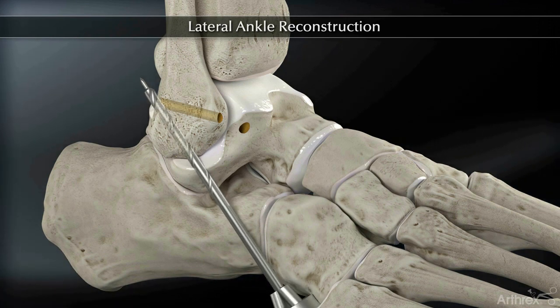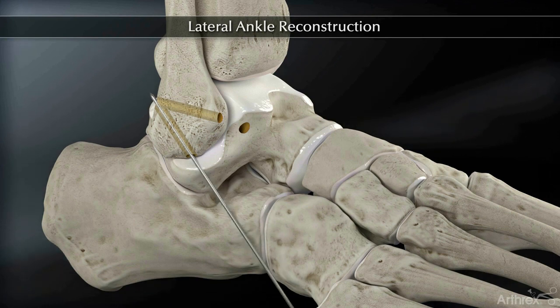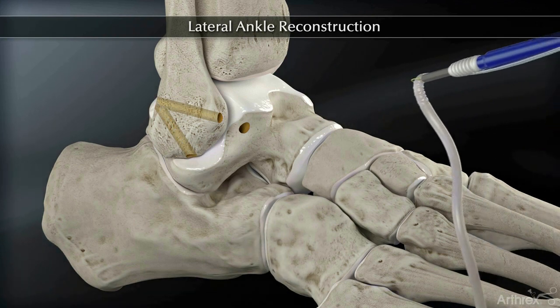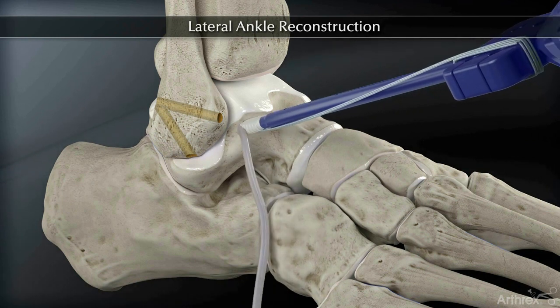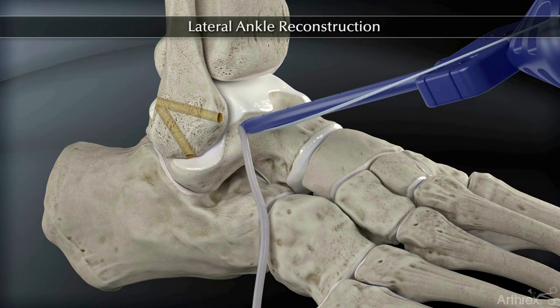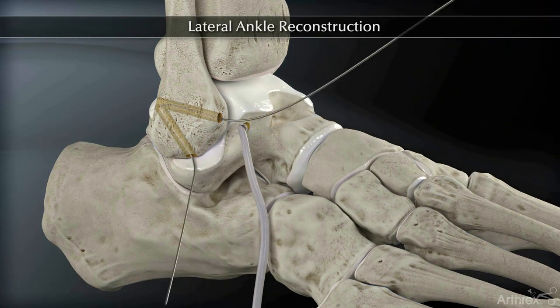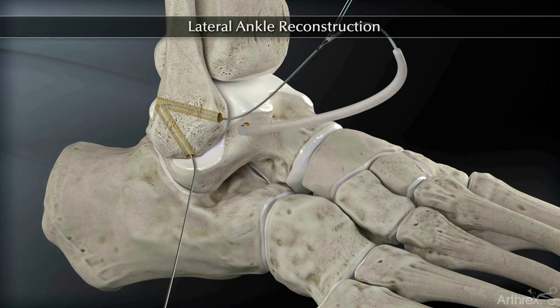Once fibular tunnel preparation is completed, load the pre-sutured allograft onto the 5.5 mm biocomposite tenodesis screw and driver and insert the tendon and screw into the talar tunnel. After fully seating the tenodesis screw, feed the nitinol tenodesis wire through the fibular tunnels and shuttle the free end of the graft through the fibular tunnels.